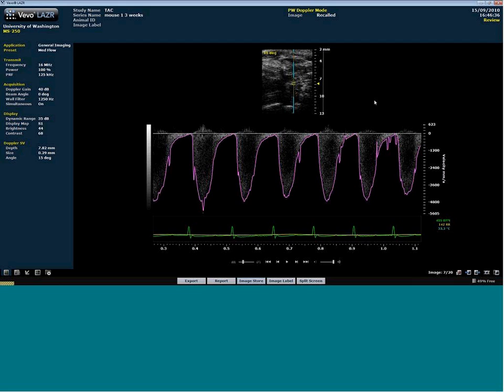I guess maybe going back even before changing probes, having models that don't necessarily have extremely high flows. So if you go back to, say, design of experiment and work with the models to maybe not create flows that are off the chart for that particular probe that you have.